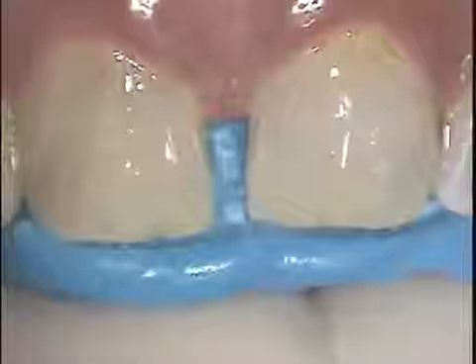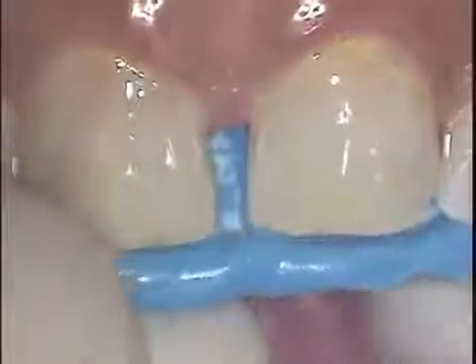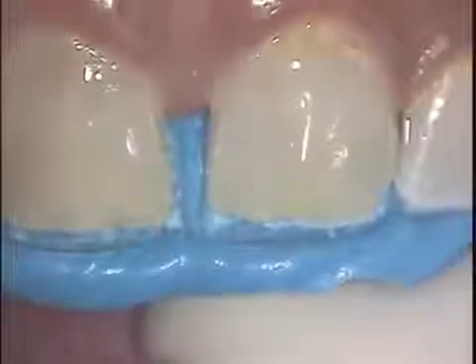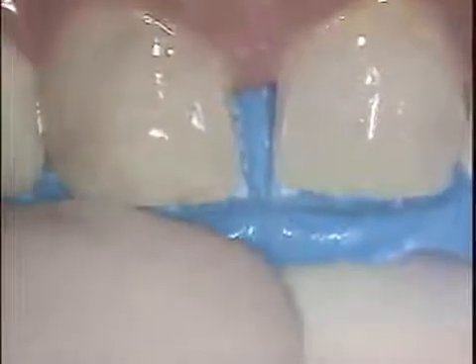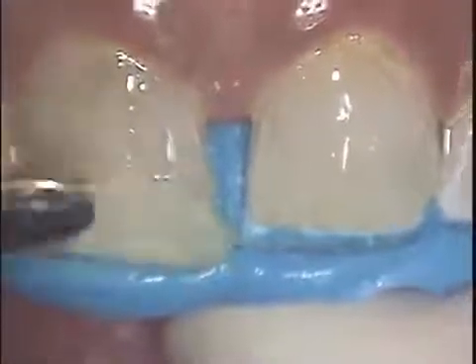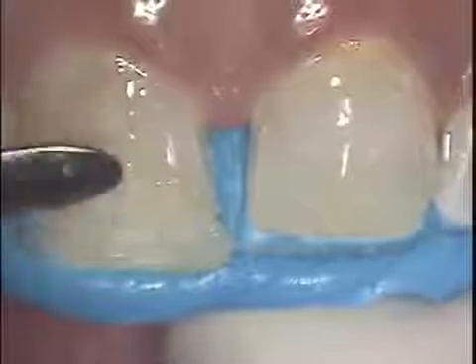Prior to this case, an impression was made of this patient's upper arch. The teeth were waxed to correct the midline, as well as the incisal length, and a polyvinyl matrix formed on the model. This is then transferred to the mouth and allows for easy placement of the Estelite Sigma paste.